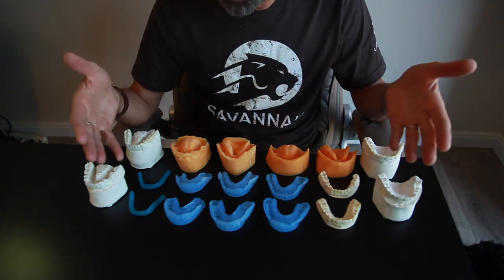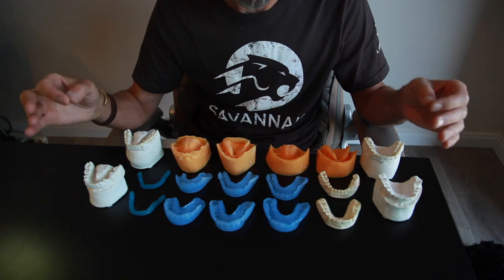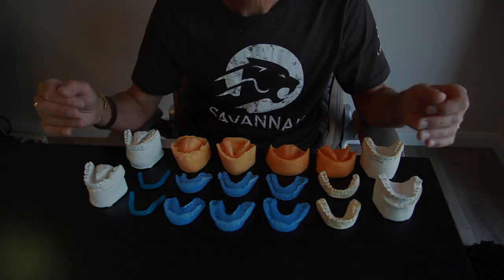This is the delivery system we use to take it from the models to the mouth incredibly accurately. I hope everyone has enjoyed this series of videos and can see that it's important that your laboratory understands what health looks like and how to help you in your office be successful.